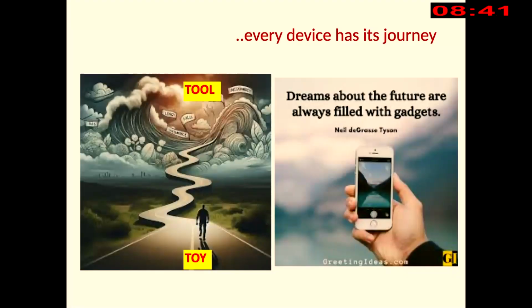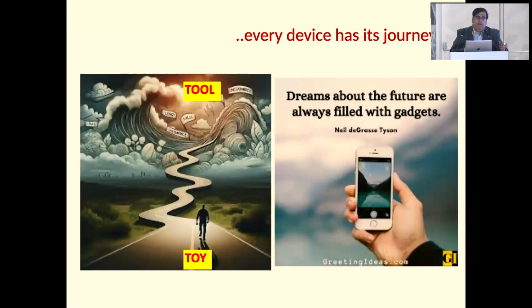I'll be talking about interpreting OCT-A findings in the setting of artifacts. I'll start off with this small slide, which also highlights our session, which talks about OCT angio as teenage tantrums. We have been taking this imaging for a few years, and initially we started off as a toddler, just starting to take its steps. From here, it is becoming a tool from a toy for us, as we have been discussing after the previous talk, how useful a tool it is becoming and no longer a toy.